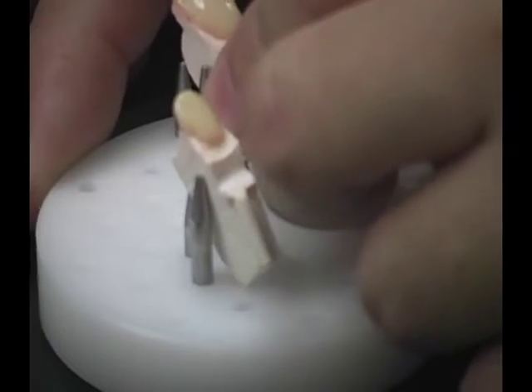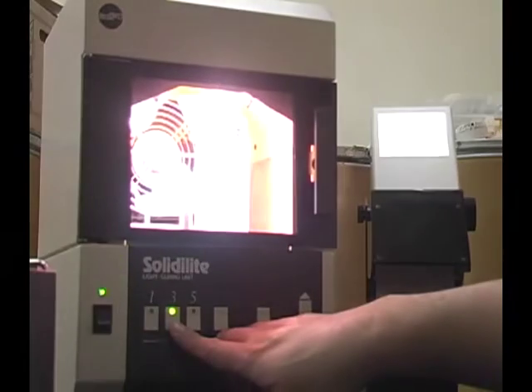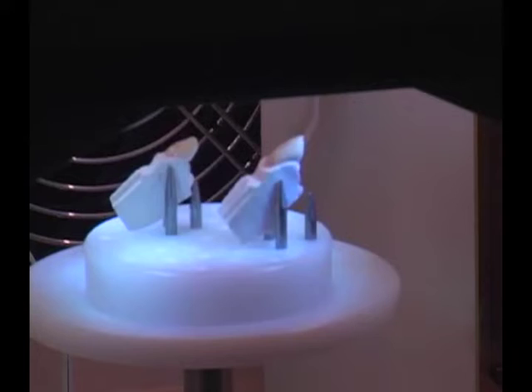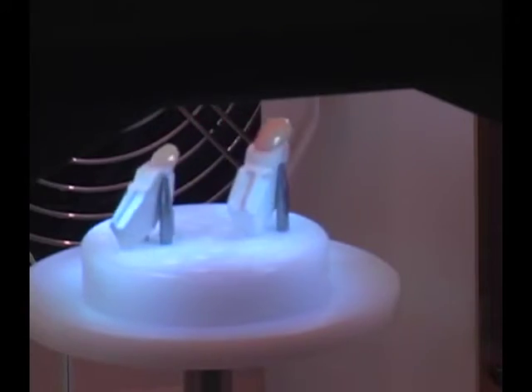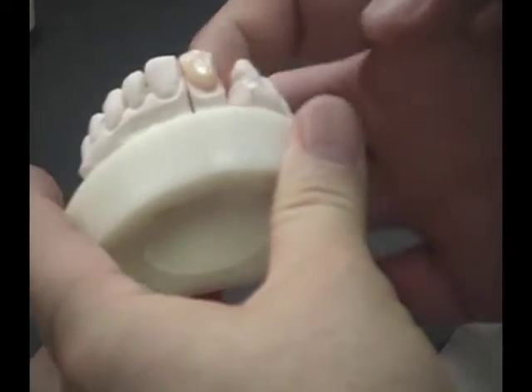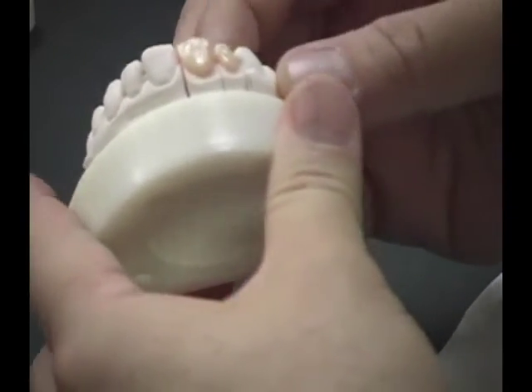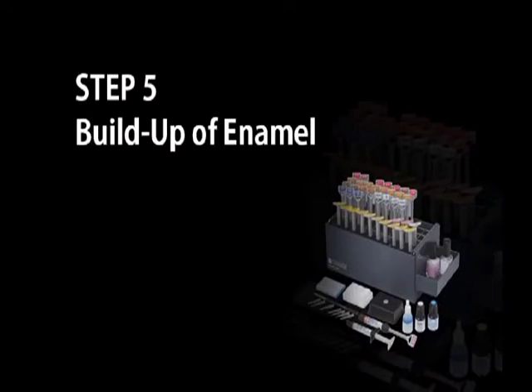When the dentin layer is complete, place in the Solidolite and cure for three minutes. After curing, place the die back on the tray.